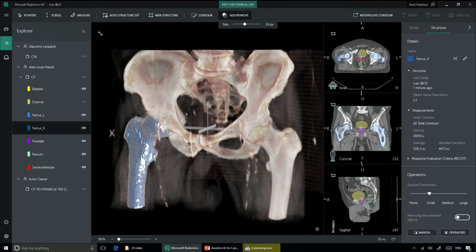So let's talk about the AI that was involved in making this actually work, because it feels a little magical. But this is the faculty summit, right? We're talking about research. Absolutely. How did this happen? You mentioned a little bit about the AI that was happening at Cambridge, like the Kinect stuff. Was some of that involved with this? Because it feels like the same kind of problem.